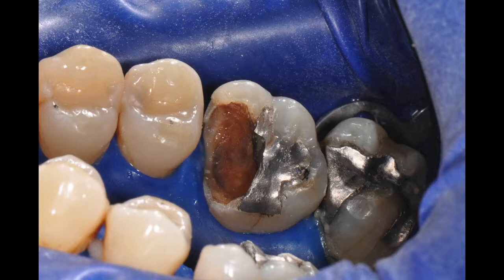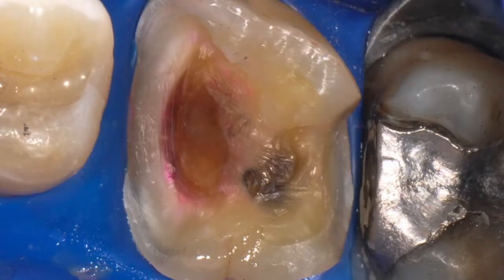Following our restorative analysis, anesthesia is achieved and the rubber dam is placed for isolation and patient comfort. The peripheral decay and all existing restorative materials are removed. The deep decay adjacent to the pulp must not be removed in order to avoid pulpal exposure. Caries detection dye is used to aid in the complete removal of caries in the peripheral areas needed to develop a seal around the deep caries.